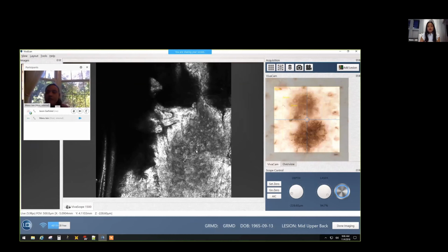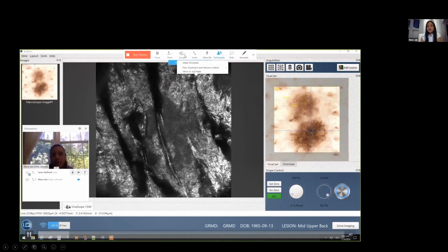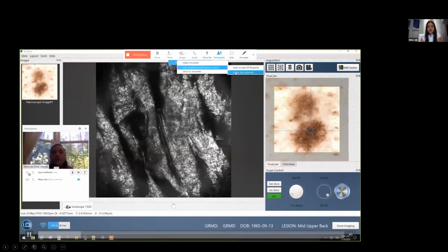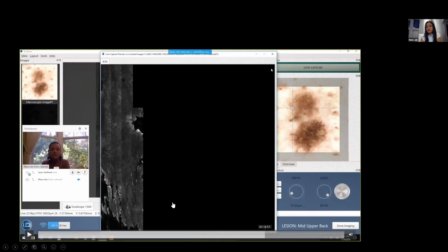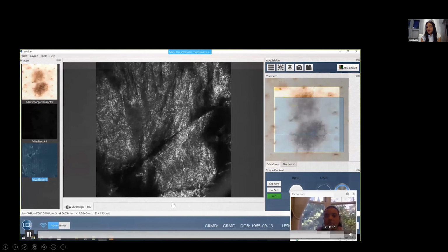Yes, I'm almost done. So this is the beauty. You see how you can see that, and they can pass me control, and then I can actually make a diagnosis, and I can forward all this very quickly. I'm making a diagnosis, I can tell them in real time, and everybody's happy.